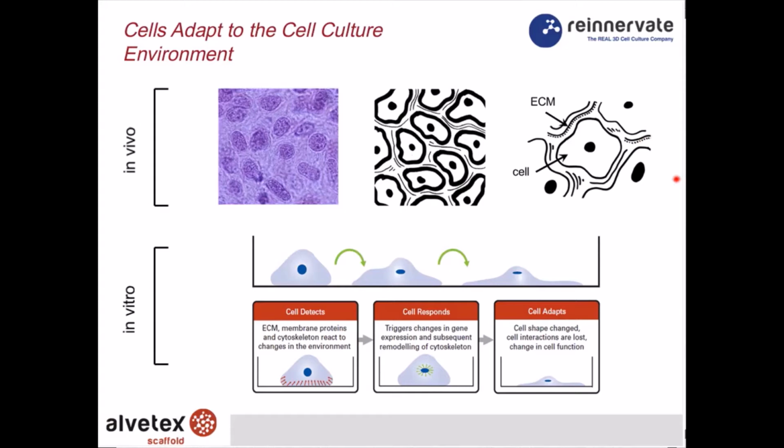And what happens in vitro, in the laboratory, we deconstruct these relationships and we place cells into vessels such as this petri dish. And cells then grow on these flat glass or plastic polystyrene substrates, most often polystyrene in multiple plates, petri dishes, flasks, and so forth. What happens, of course, is the cell changes its shape. You can see it flattening to adapt to that flat foreign environment. And when that happens, there are changes to the cytoskeleton, remodeling, changes in gene transcription, protein translation, and function.